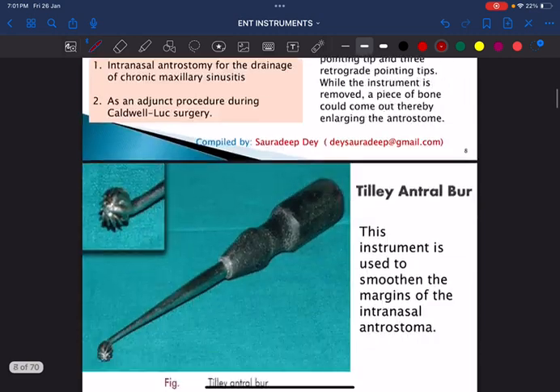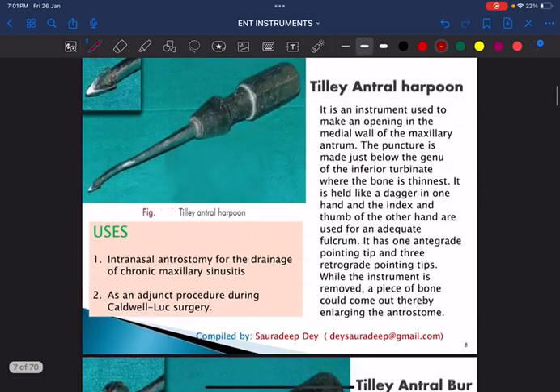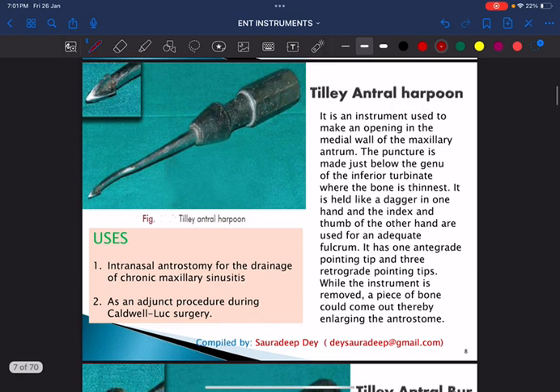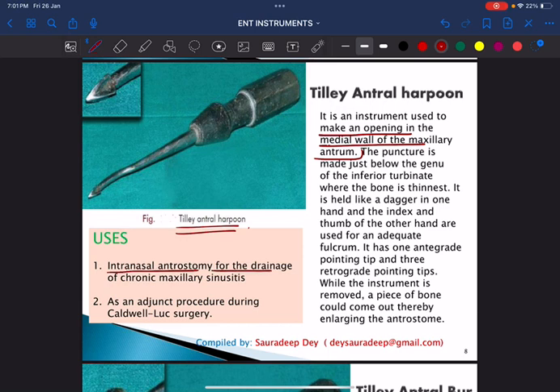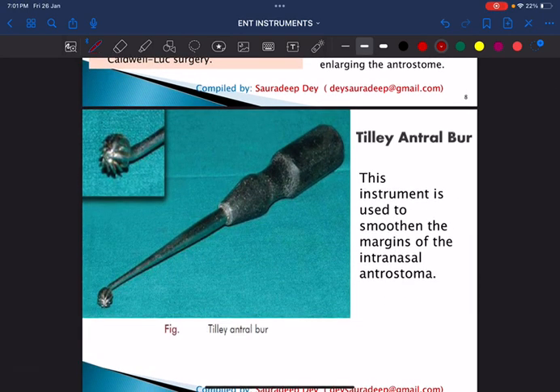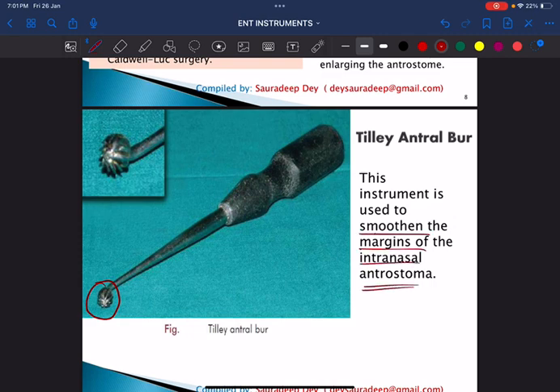This is called the Tilley antral harpoon. It is an instrument used to make an opening in the medial wall of the maxillary antrum, mainly used for intranasal antrostomy in cases of maxillary sinusitis. Next is the Tilley antral burr — you can identify it by the flower-shaped structure at the end, called the burr, which is used to drill and smoothen the margins of the antrostoma.